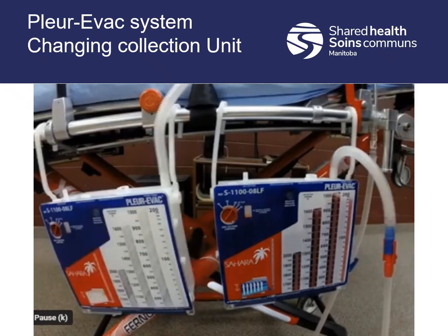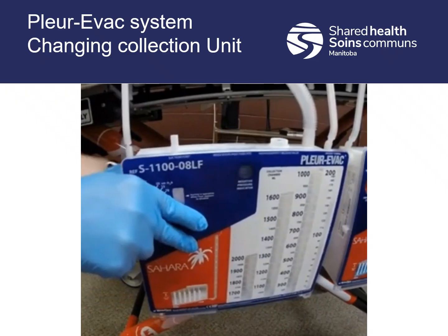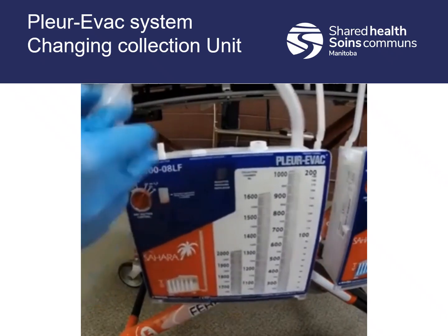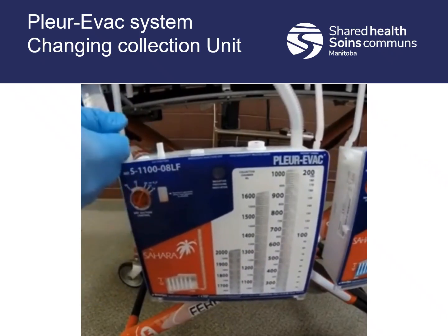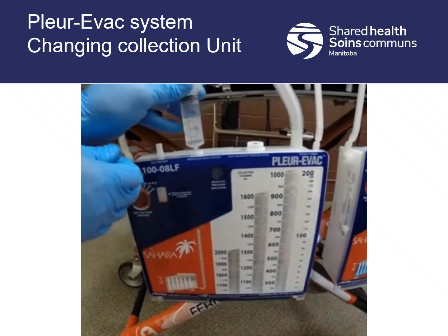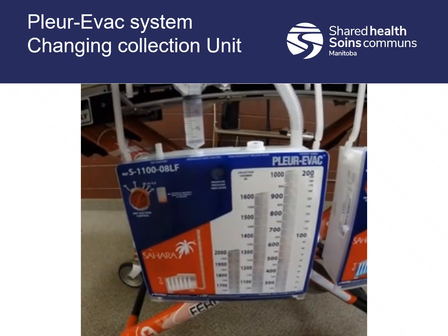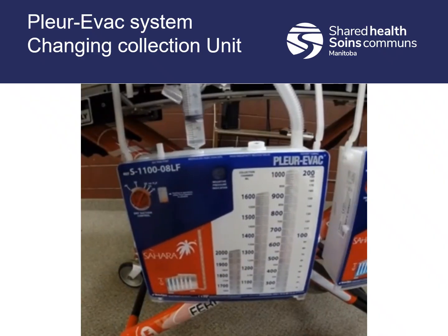So what we're going to do is take the pre-filled syringe from the back of the unit and fill up the air leak chamber. As we mentioned before, we've got that fluid there. We take the cap off and we just insert it at the port at the top of the device. You can see there's no fluid right now, and as we insert it, the fluid's clear when it goes in, but it turns blue once it's in the device. And we just do the whole syringe. It's preset. You don't need to decide how many mLs it is. You just put the whole amount of fluid into the device.